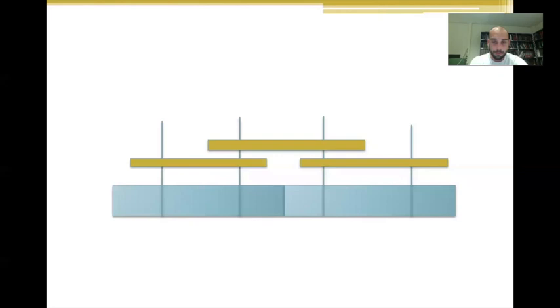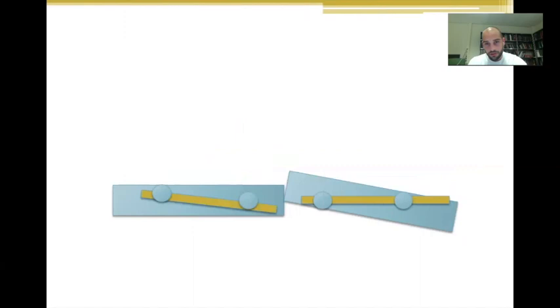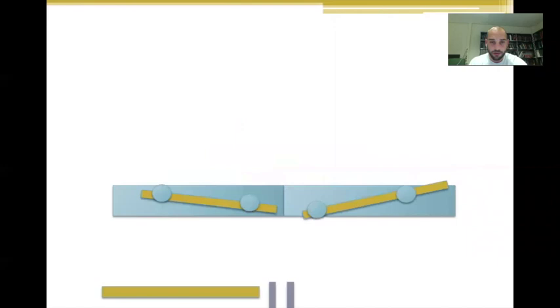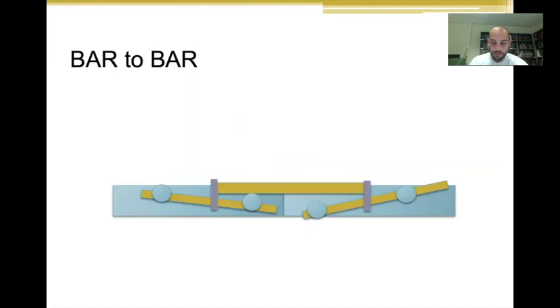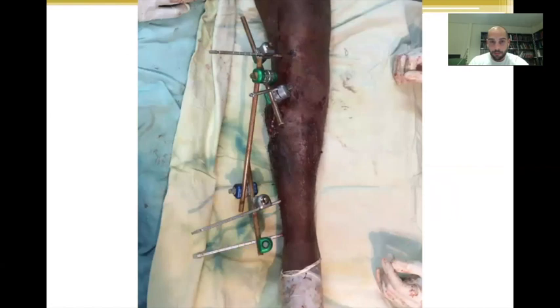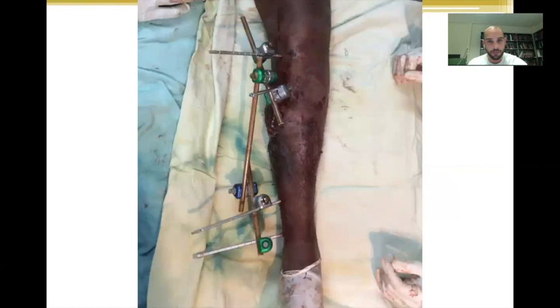Here you see an example of a bar-to-bar external fixation where the alignment has been done correctly. The pins in the proximal and distal parts are a bit crooked — not precisely correctly inserted — but using a bar-to-bar technique you still get perfect alignment of the fracture and a good chance for healing. This is the most realistic way to reduce a fracture with external fixation.